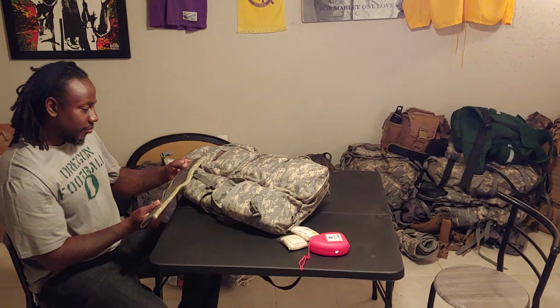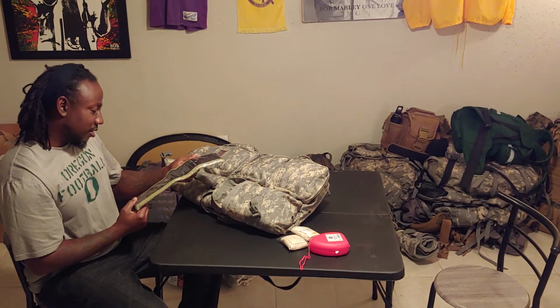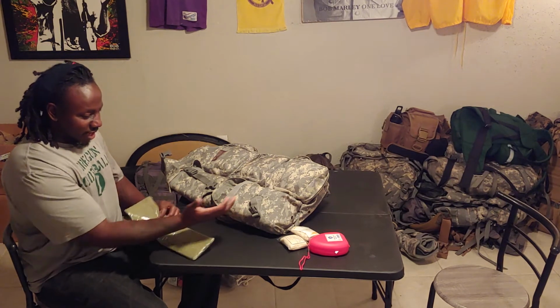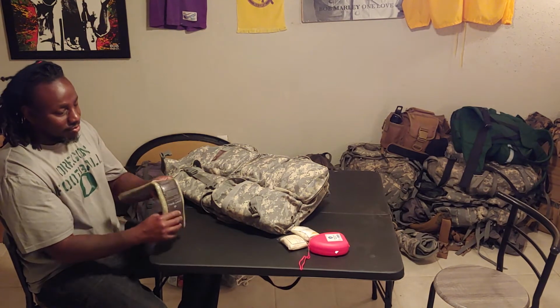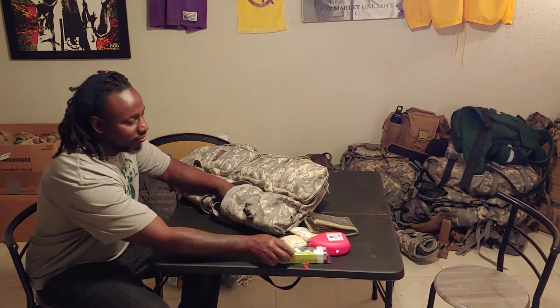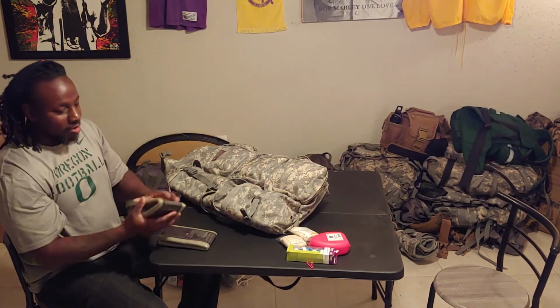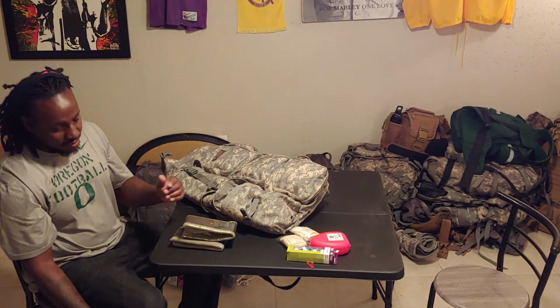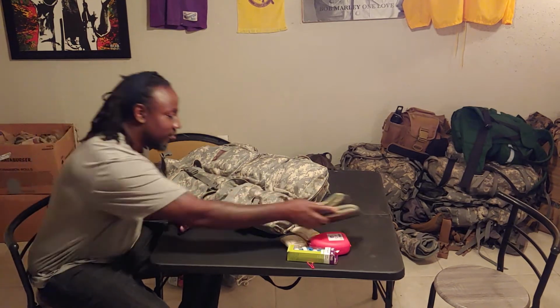Is this a SAM Splint or North American Rescue? I think this is the SAM Splint, where if you have an arm injury, I forgot how that goes. You go boom like this, and then you wrap it and form it to their arm. Okay. Finger splint for your finger. Another splint. You can make a real good cast if you want to. If it's just one individual with a hurt arm or ankle, instead of just doing the one, you can do 2. One on the bottom, one on the top there.